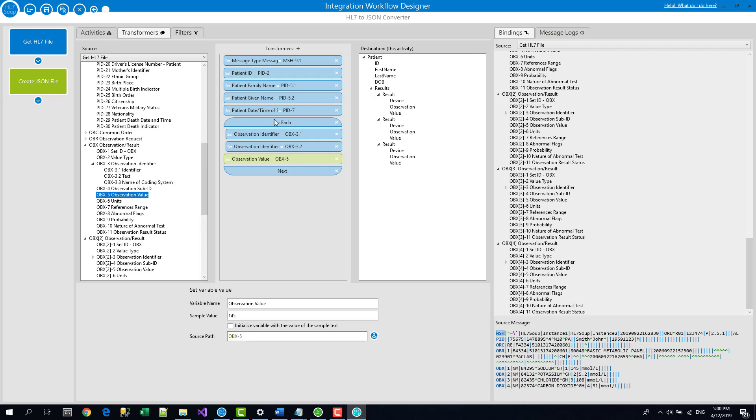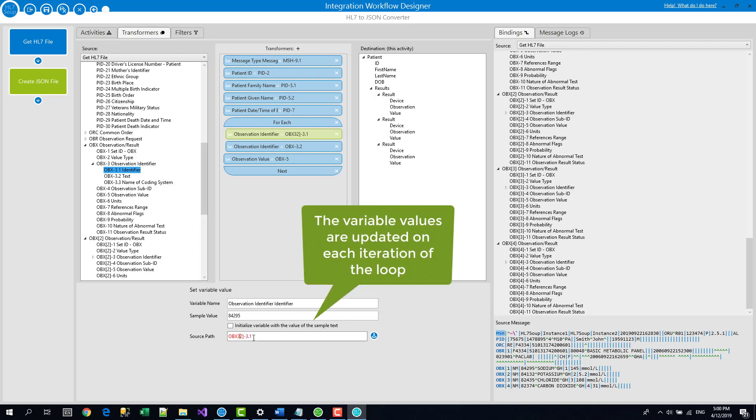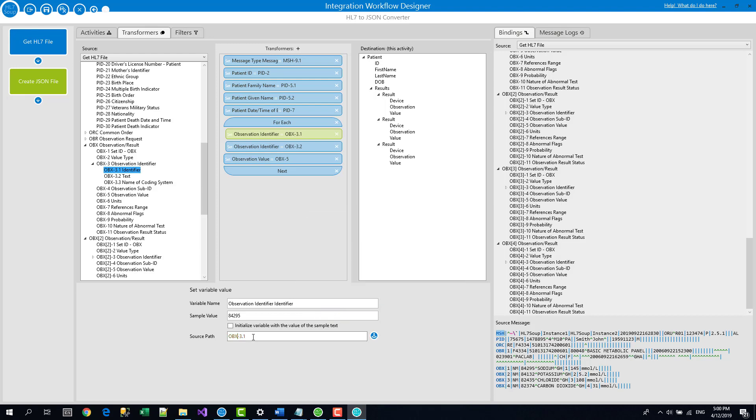Okay, so what's that doing here? That's going to loop over all the OBXs and it's going to populate these values. And you'll note that it just says the OBX 3.1. So because it's in a for each, what that's going to do behind the scenes is effectively it's going to put an iterator. So the first loop, it's going to be OBX 1. Second, it's going to be OBX 2. Third, it's going to be OBX 3. It's just going to replace it automatically for you. Make sure you don't actually have any iterator brackets in there, because if you do, it's going to use them precisely. So it only replaces them if it's not defined inside the actual message path, which is the default incidentally when you drop them in. So there's no worries there.